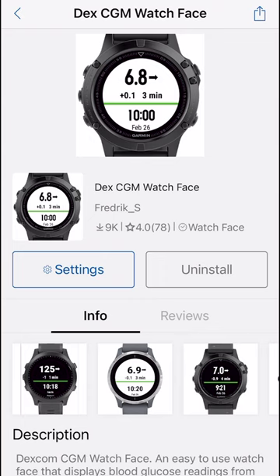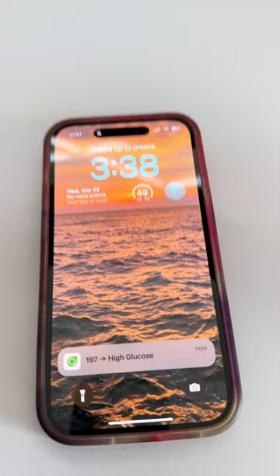I found a user-created watch face that shows my levels right next to the time. The watch connects to smartphones, so when I receive any alert, I get them on my watch too.